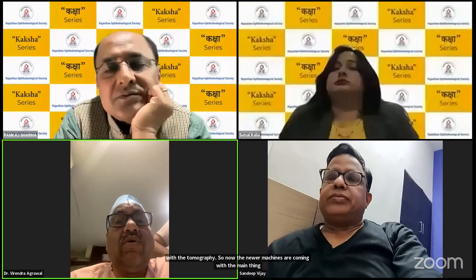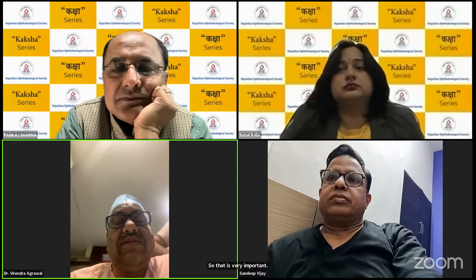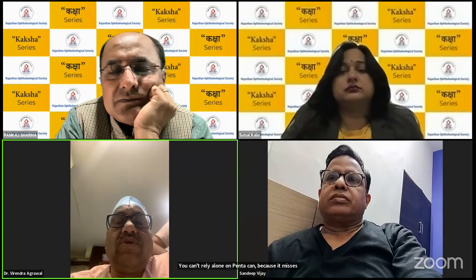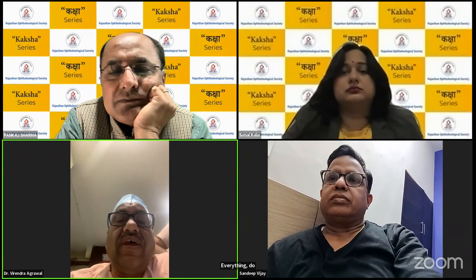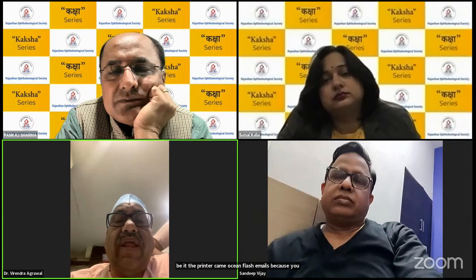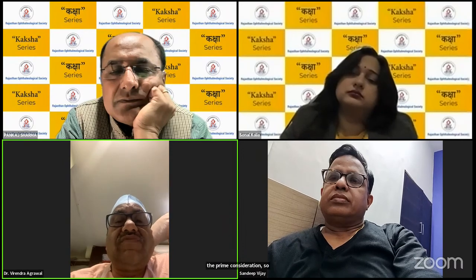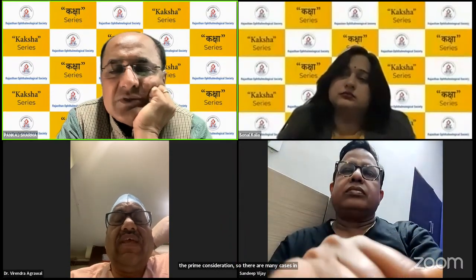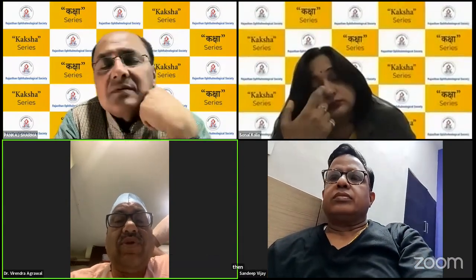You can't rely alone on Pentacam because it misses something, and sometimes you find things are there. Everything does some extrapolation, be it the topography, the Pentacam or the Scheimpflug image. Because in Scheimpflug, the best fit sphere or the thickness are taken into prime consideration. So there are many cases in which anterior and posterior surfaces are normal, but because thickness is very low, they create a doubt in you.